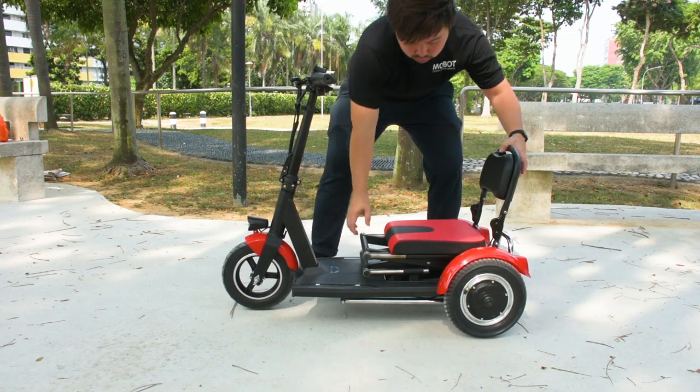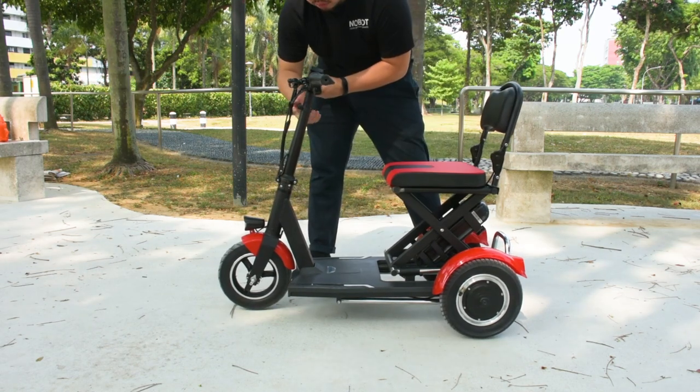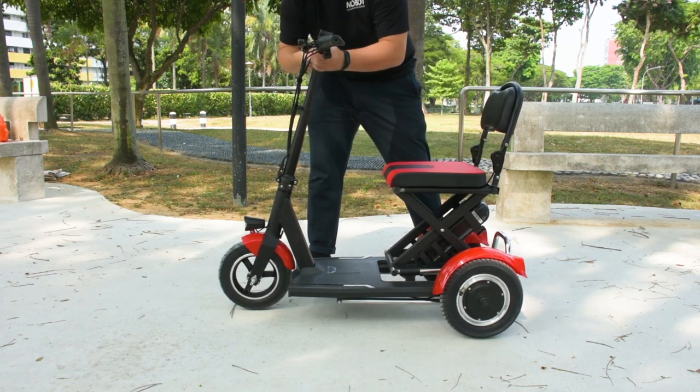To pull the seat up again, pull on the latch behind the backrest and raise the seat up. The final step will be to raise the handlebar to the desired height.